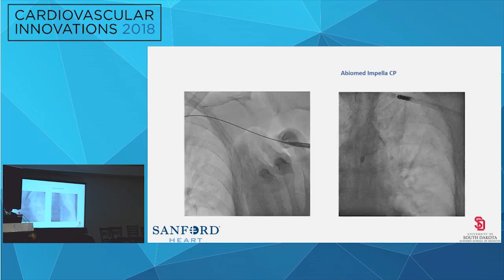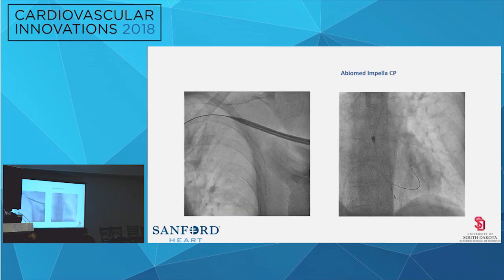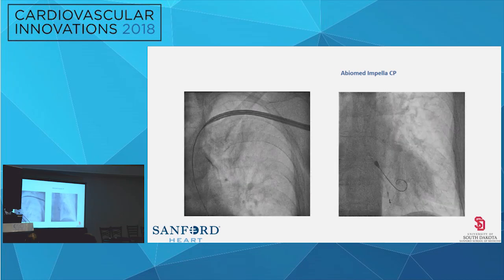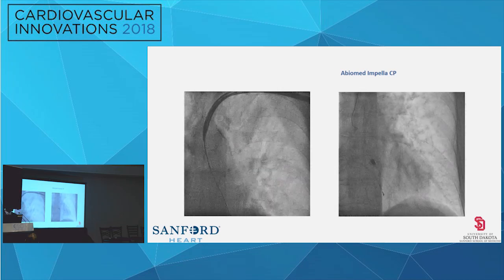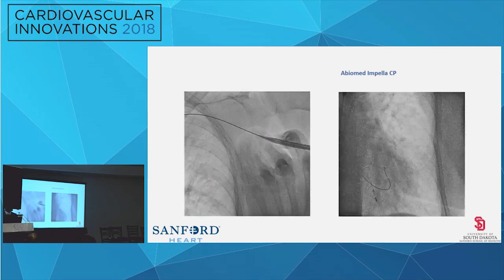And then this was followed by the Impella placement via the left-sided subclavian access. We thought the left access is more feasible because it is more in trajectory with the heart and also carries less risk of stroke compared to the right-sided access.